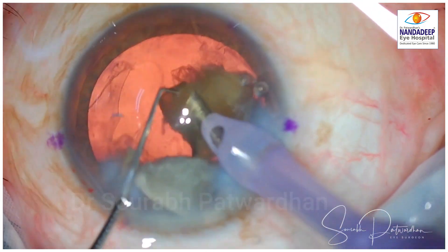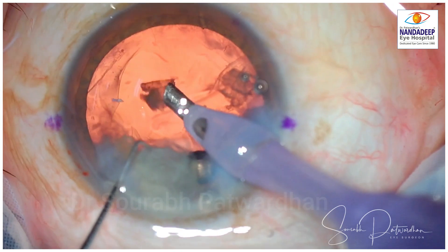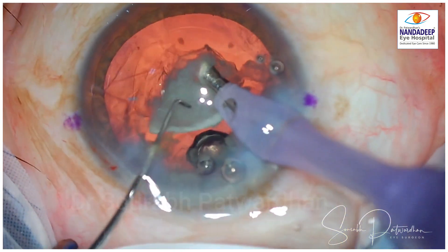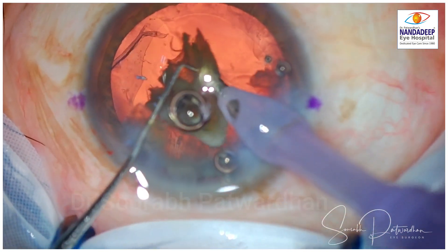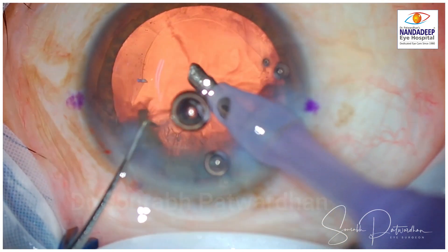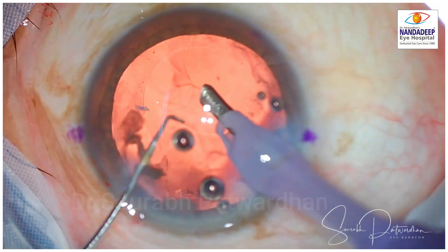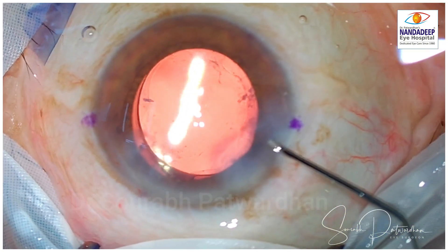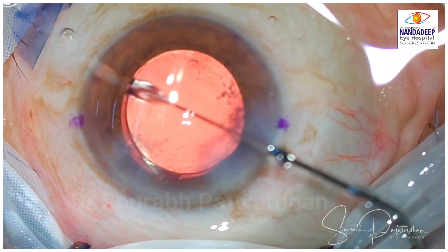LRI generally makes the eyeball a little bit more elastic. During LRI, one of the major complications is perforation. If there is corneal thinning at the site of LRI, you have to be very cautious and avoid LRI in those cases. If there is a perforation, make sure you take multiple sutures, because it is a perpendicular incision — whenever it perforates, there is no sealing effect, so you have to place sutures at every half to one millimeter; otherwise it will keep leaking.